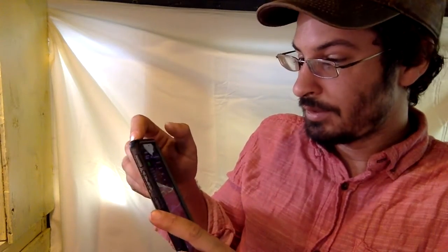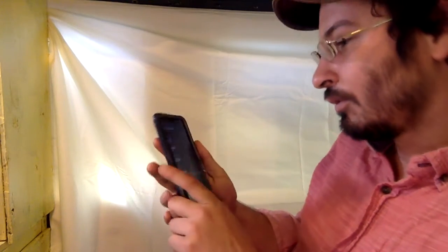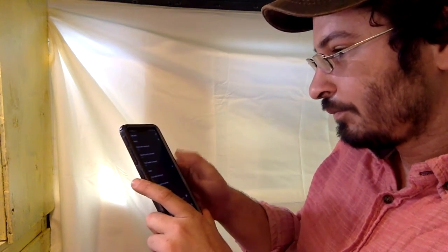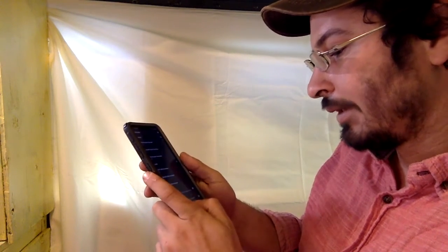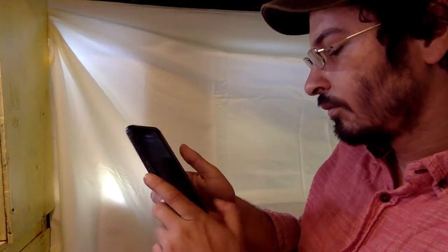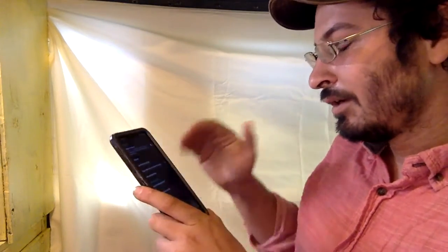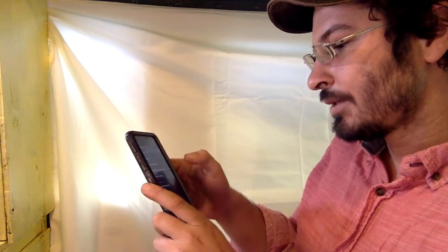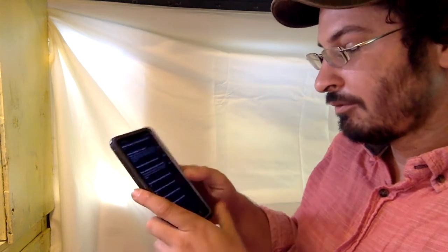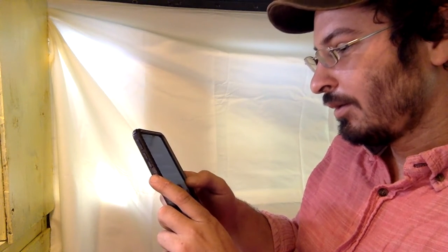Up here you have preferences. I'm just trying to remember if there's any gems that I wish I had known. Buttons. Calculator button is your most important. Calibration button. Quick wizard settings, like if you have a meal you regularly eat, you can make that as a button you can press. Enable super bolus, that's a feature that you can learn about how to use. Max allowed bolus and carbs.